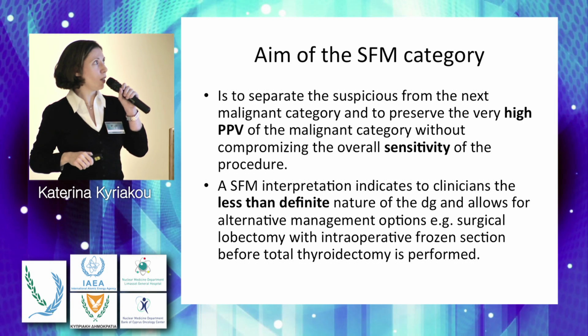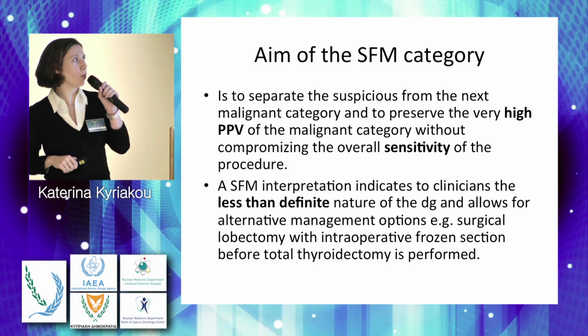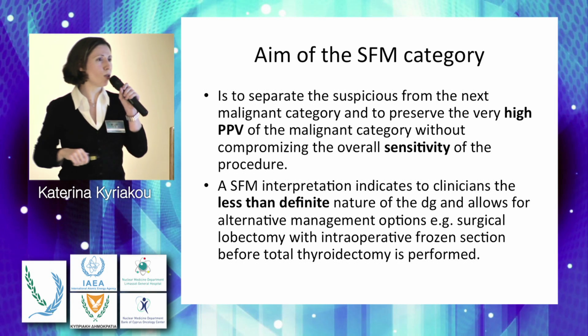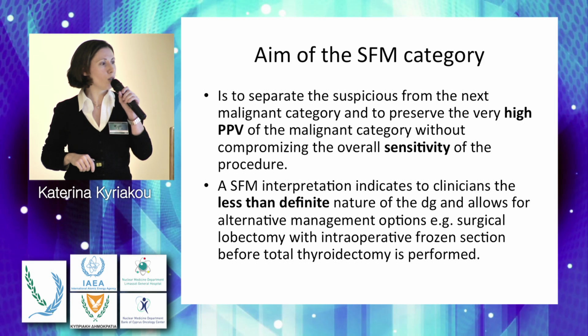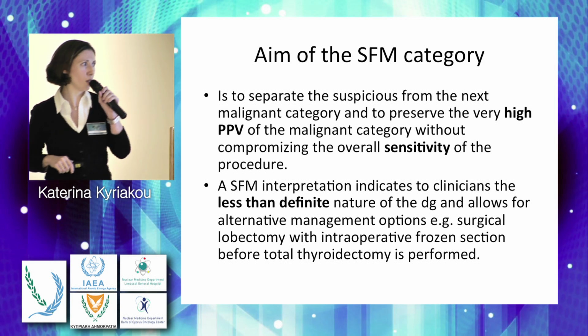The aim of this category is to separate this suspicious category from the next malignant category and to preserve the very high positive predictive value of the malignant category without compromising the overall sensitivity of the procedure. And this interpretation indicates to clinicians the less than definite nature of the diagnosis and allows for alternative management options. For example, surgical lobectomy with intraoperative frozen section before total thyroidectomy is performed.